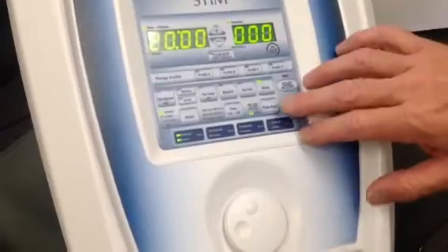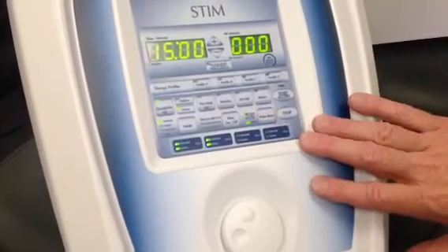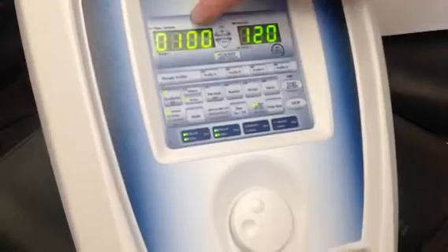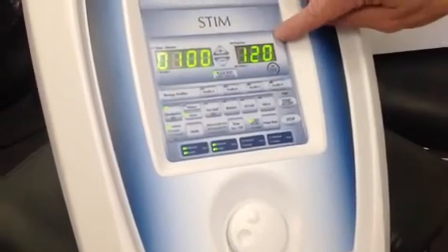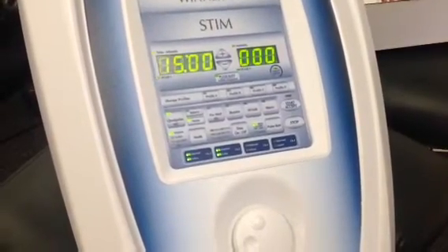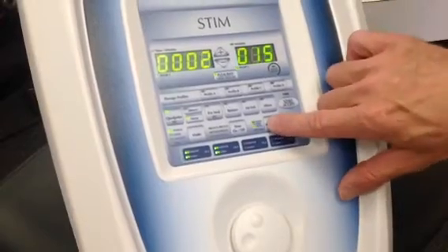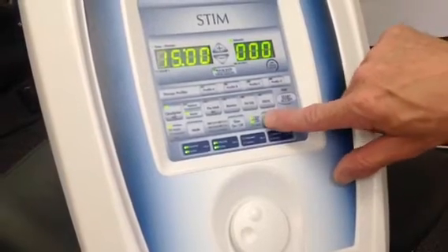All right? So over here, let's go back to quad, on your pulse rate button, you have a high, a high-low, and a fixed. Okay? So your high is when you push your pulse rate button, quadrupolar automatically has a 100 to 120 frequency sweep. So you have a frequency sweep so you don't have nerve adaptation or accommodation. Okay? So if you push high, it's going to stay on the high. If you push low, it's going to change down here from 2 to 15 pulses per second.